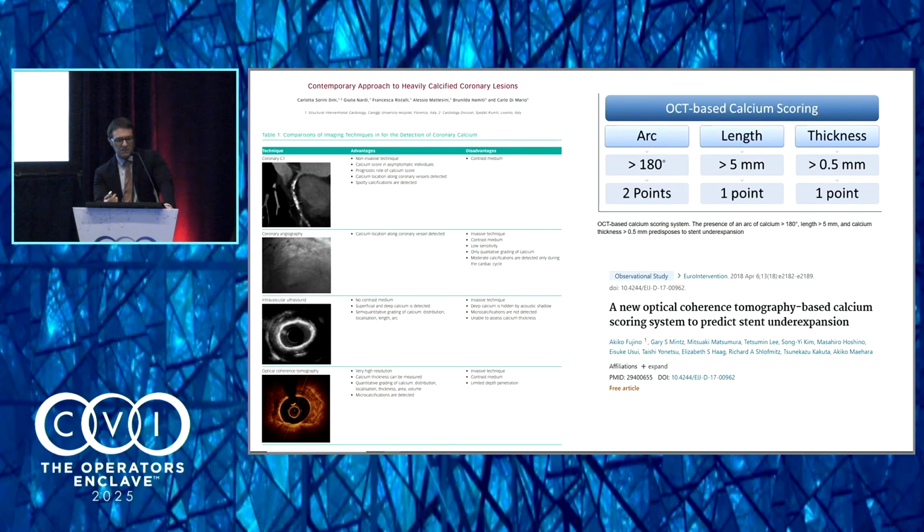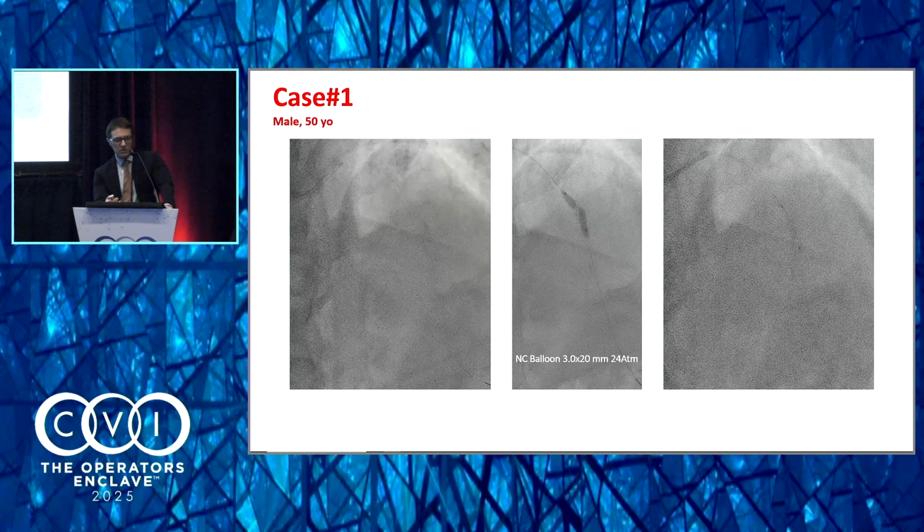So in the modern approach, what we do in Germany, at least, is perform much more CT scan before we put a complex PCI on the table, so we get much more information about the distribution of the calcium. I don't know how it is in the US.